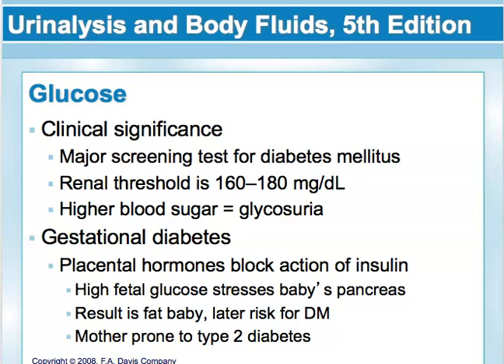So that could be in cases of hyperglycemia, which is when blood glucose levels become elevated, which occurs in diabetes mellitus. But glycosuria can also be seen following a meal that has a high glucose content. So it's best to obtain a specimen that's collected under controlled circumstances.